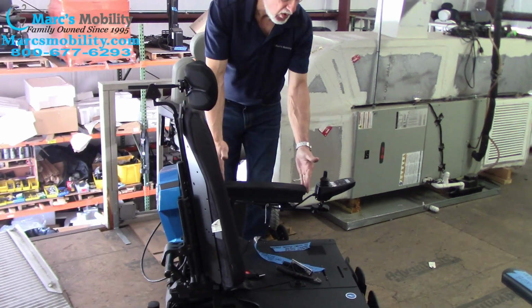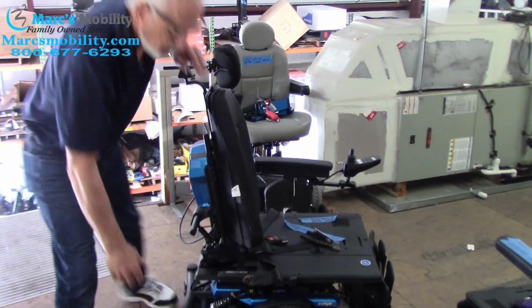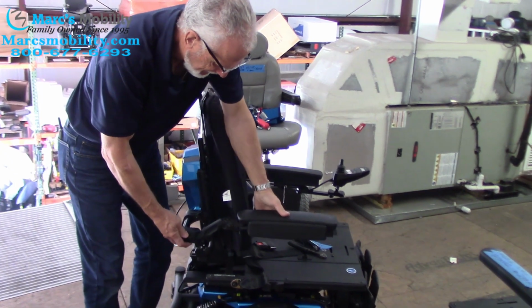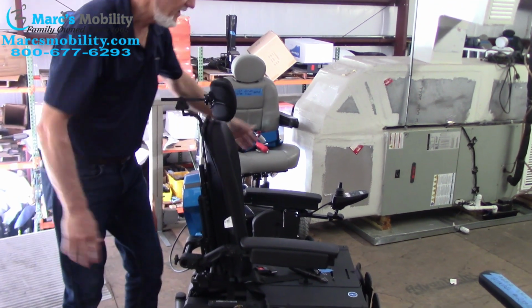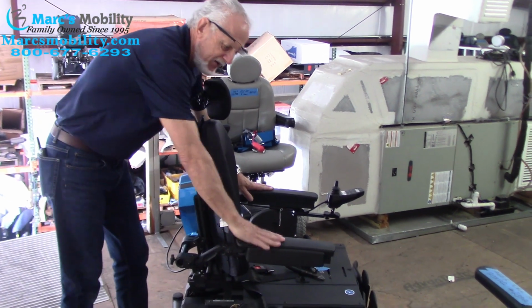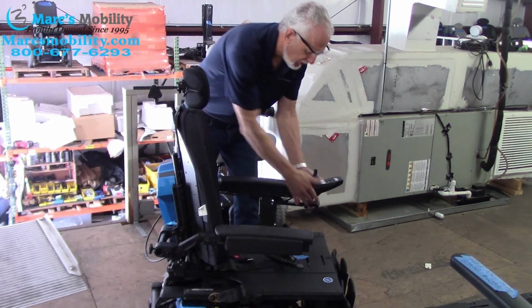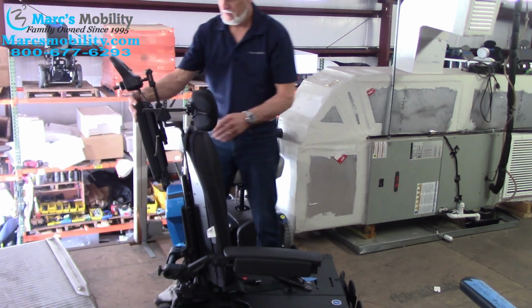And I'm going to send you a long arm so it's going to be right at the end of your joystick. And then you'll put your other arm back on here where the joystick was at. You'll put that arm on here, so I'll send you 2 arms, but I want these back. So when I send you the arm, the swing away joystick will be probably, well, it's not hard.